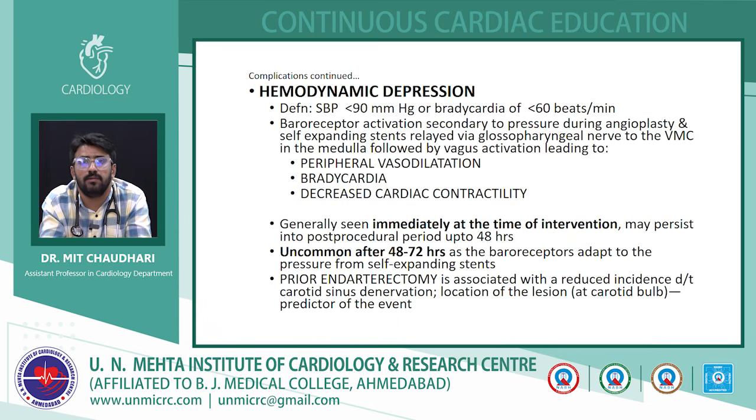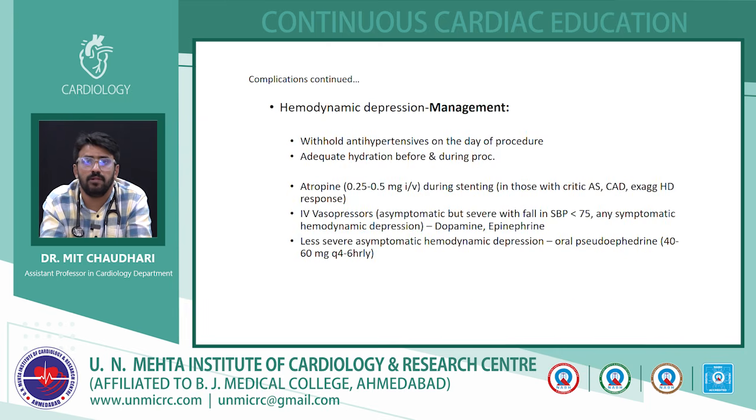During the procedure, one can develop hemodynamic compromise, as I have already told, because of baroreceptor, carotid receptor activation. Because of pressure due to the stent or the post-dilating balloon, one can develop hypotension with low systolic blood pressure and severe bradycardia. In such patients, it is important to immediately intervene using either IV fluid or atropine. Many operators give atropine prior to the stent implantation or post-dilatation to prevent the hemodynamic compromise.